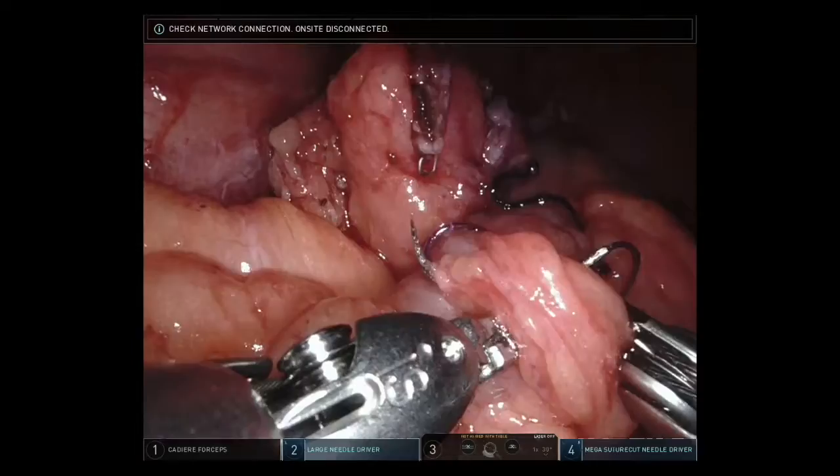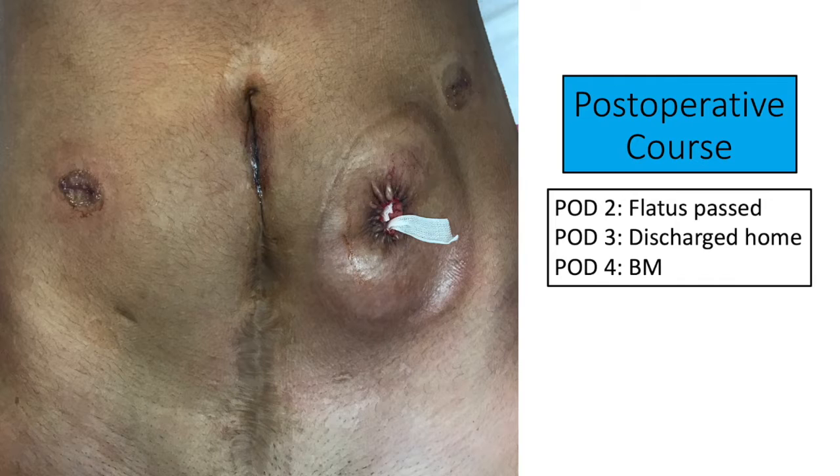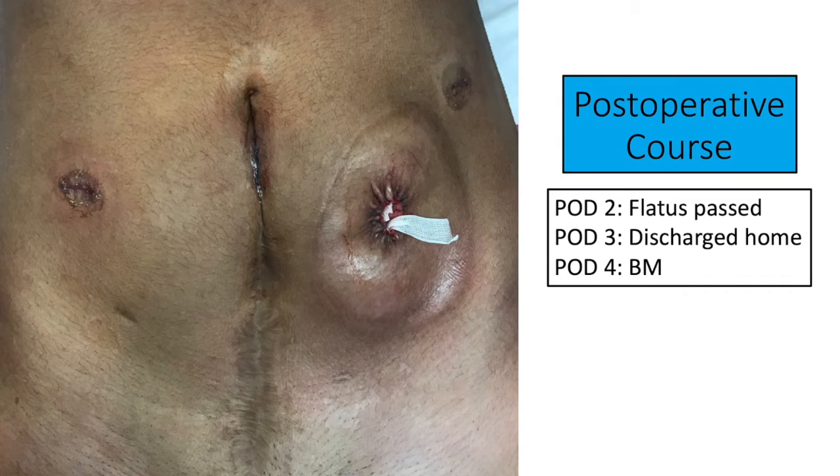After completing the anastomosis, the needle and the instruments were removed. We then took the specimen out through the gel port platform. The fascia was closed at the colostomy aperture site, and the dermis was closed with a purse string using a 2-0 vicryl. The patient's post-operative course was uneventful, with flatus passed on post-operative day two and discharge home on post-operative day three. She had full return of bowel function on post-operative day four while at home.